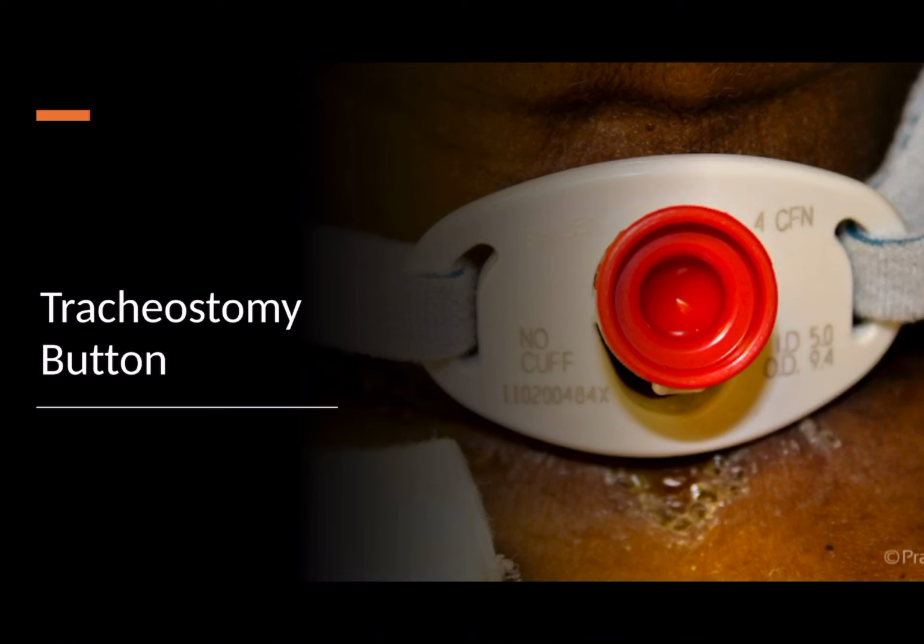If you have a patient who's suddenly deteriorating, always take that red cap off before putting on the water circuit or the ventilator. Because obviously if you try to connect it, it probably wouldn't fit, but even if you manage to jam it on, you're not going to be able to get any air through because the whole tracheostomy hole is covered up.